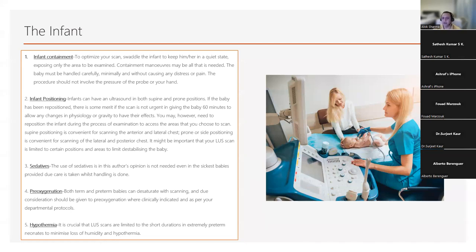Okay. So we've kind of looked at indications. I've enumerated all the indications I can think of in the chapter on basics of lung ultrasound. If you guys can come up with other indications, I would be very grateful. But what is really, really crucial from our perspective is that when we talk about indications, we might be doing lung ultrasound because we've got a clinical query, or we might be doing lung ultrasound because we've got something on radiology that is actually confusing. You know, the question is, do we have a pneumothorax or is that a skin fold? Or we might be doing a lung ultrasound because we're trying to differentiate RDS from transient tachypnea of newborn.